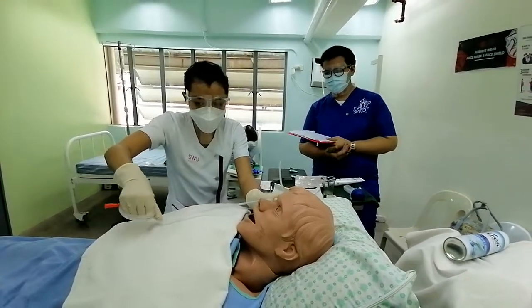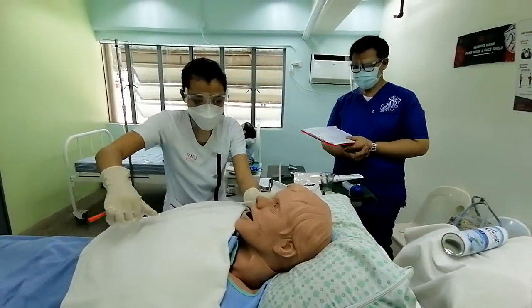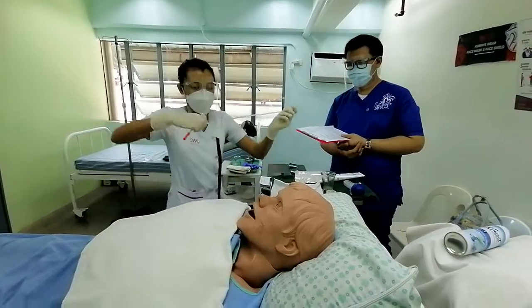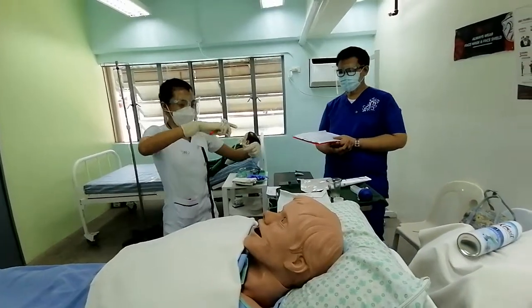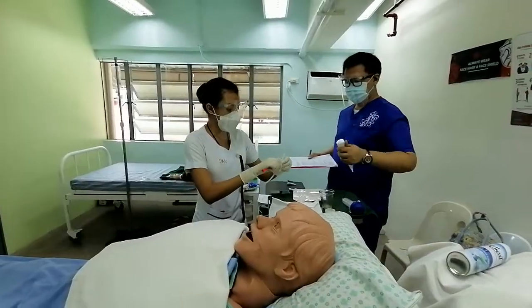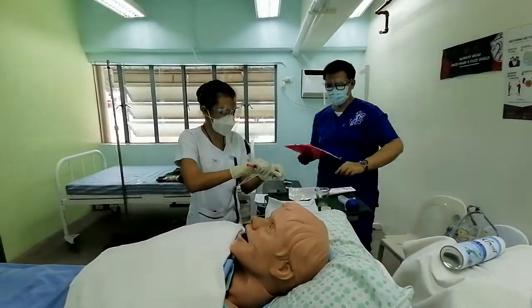And then advance 2 inches, and then place a mark. After that, I will lubricate the tube in order to facilitate easy insertion. Lubricate 2 to 3 inches.